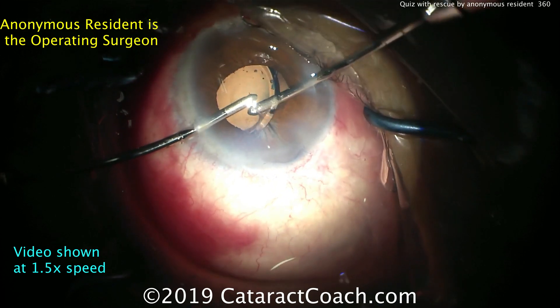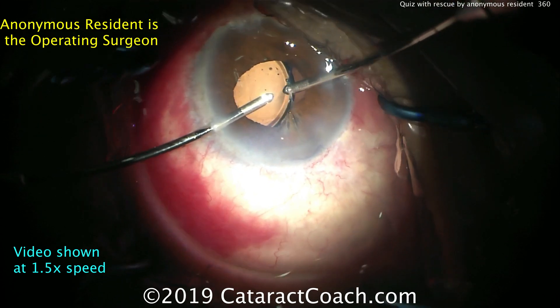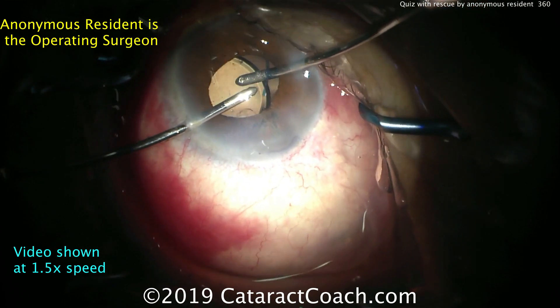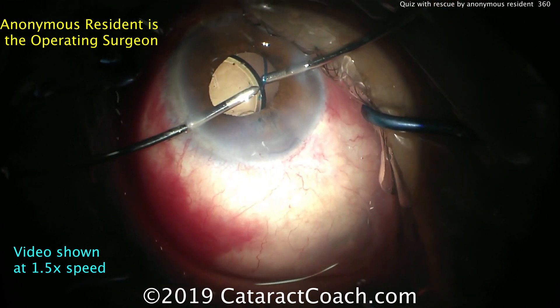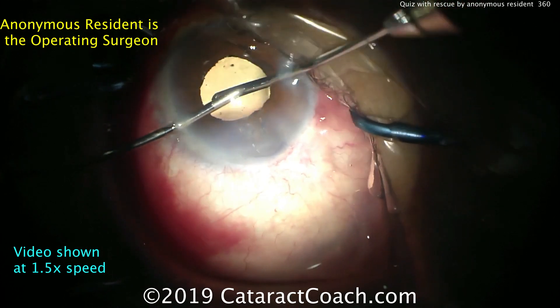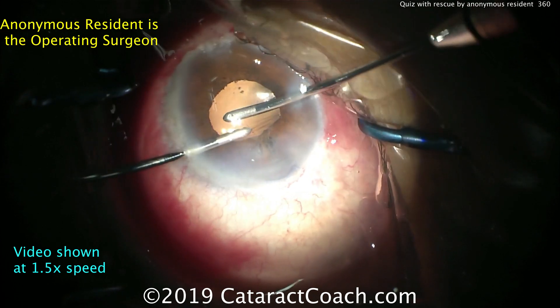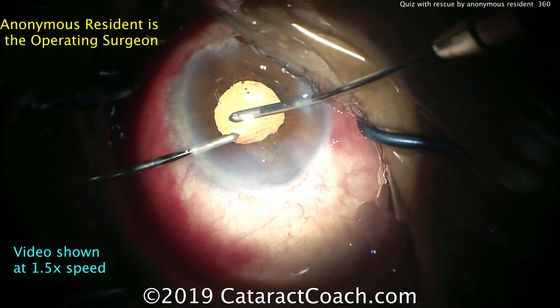Now removing viscoelastic — be very careful going behind the IOL here; you don't want to cause vitreous to come forward. We can make sure the lens stays centered and nicely positioned in the ciliary sulcus. Removing the rest of the viscoelastic — everything looks pretty good. There's a little bit of iris stranding coming into the IA port, and that'll be of no concern; we can just let go of that.